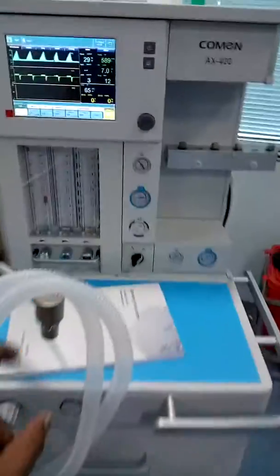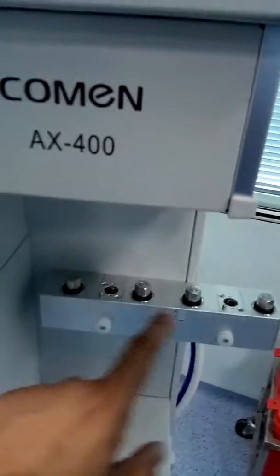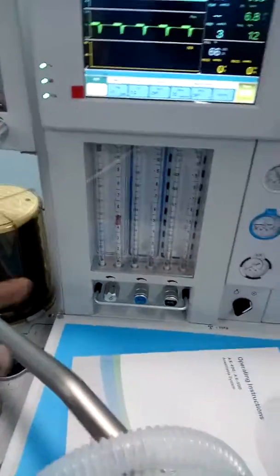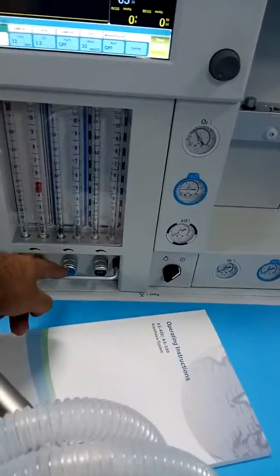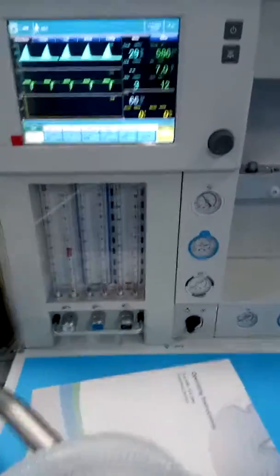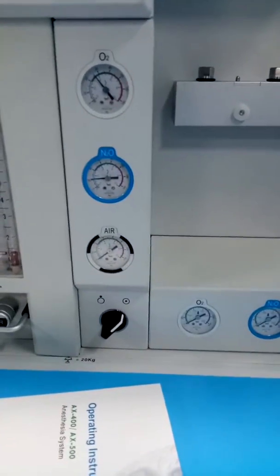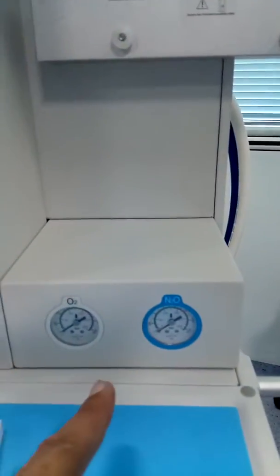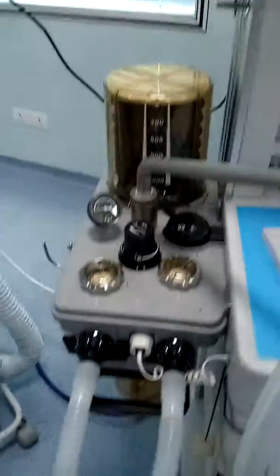This is the Comen Anesthesia Workstation model AX-400. In this machine you have the option for two vaporizers, which are not installed yet. This is a three-gas machine, also available in a two-gas configuration. You can get oxygen and nitrous oxide — nitrous is optional. Here you can see the pressure meter for the pipeline, and these are for cylinders. This is the on/off switch for this machine, and this is the circle absorber.